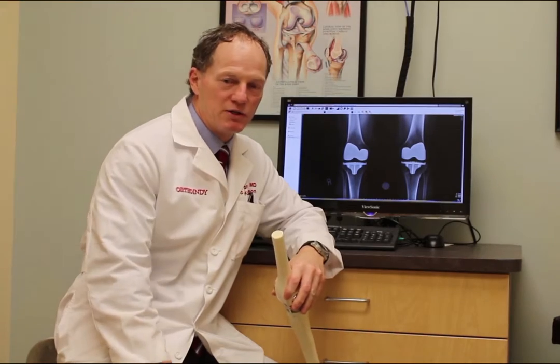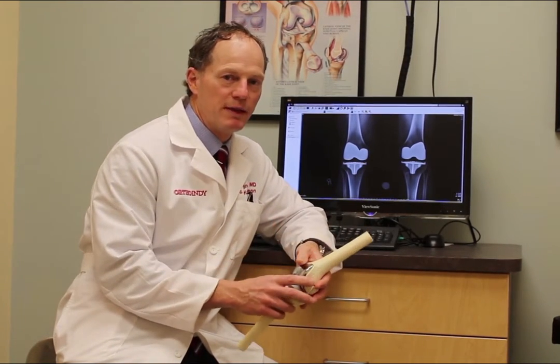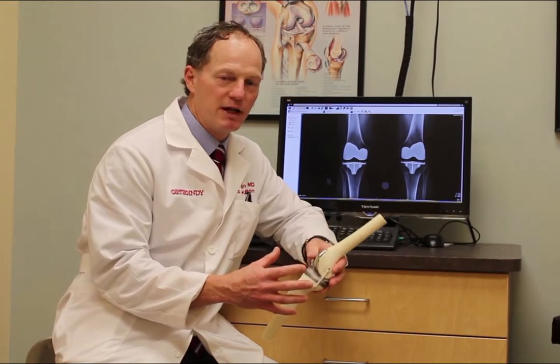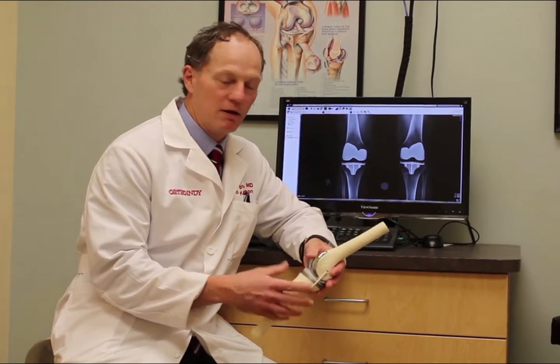What we do during knee replacement is resurface the ends of the bones and give you a new joint surface. A lot of people think that knee replacement involves cutting large chunks of bone, taking them out and putting some big mechanized device in the knee, but that's really not the case. I'll demonstrate that with this model.